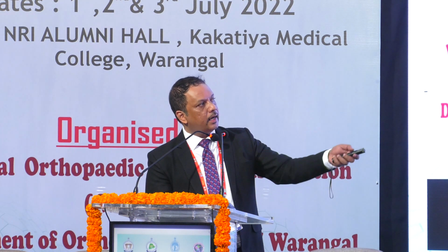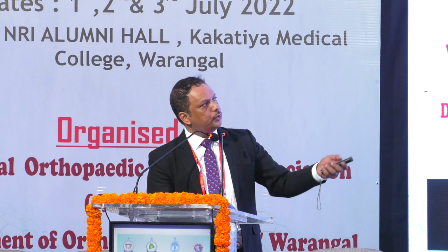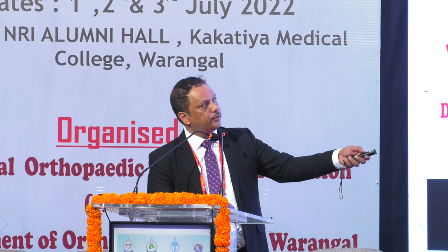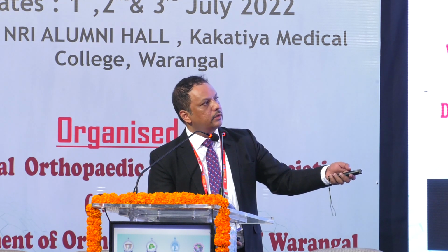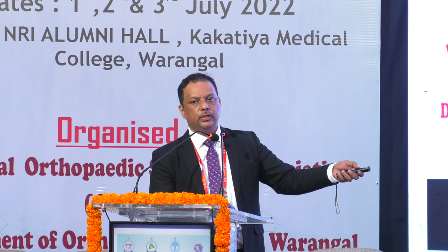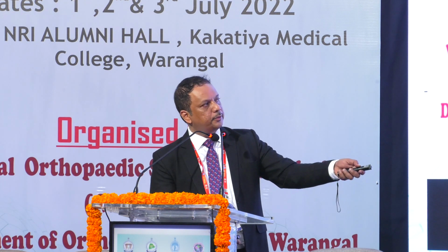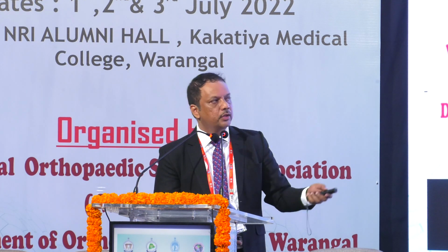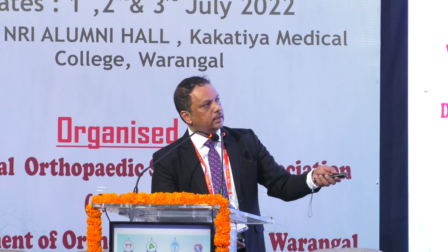These are very bad rim fractures. It's almost like a burst fracture, very, very distal. You need to see where these fragments are. These are free floating fragments here at this point. And you need to have a very flexible approach here. You have these rim plates here which go all the way, they cross the watershed line here. They are low profile at this point. These screws actually go proximally, not distally towards the joint. So it's a very important kind of design, and you can hold them on like this.